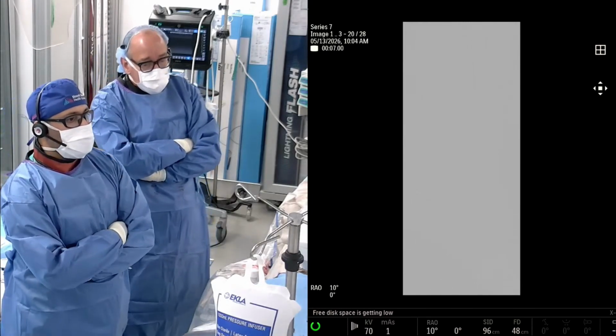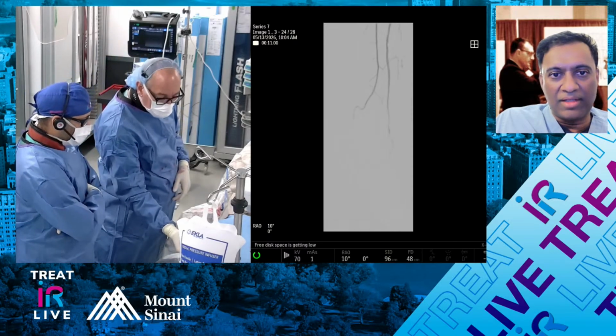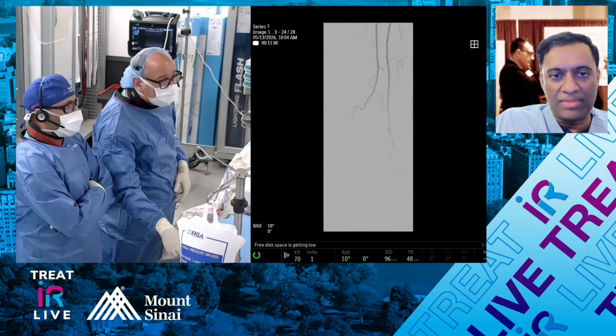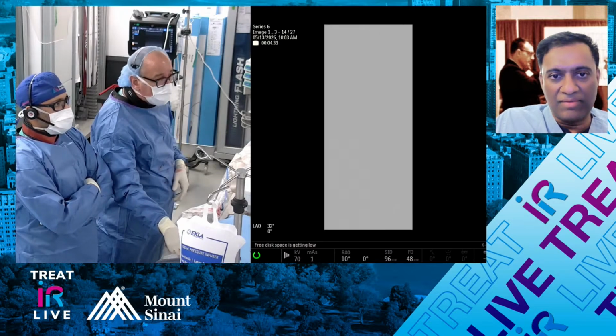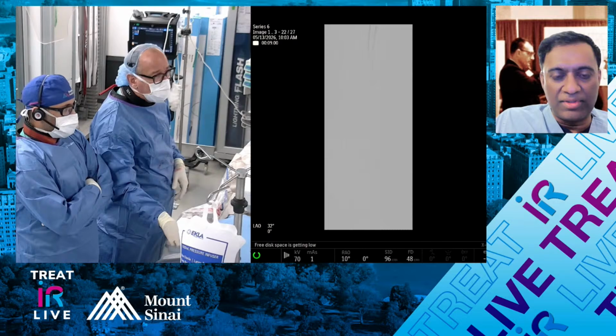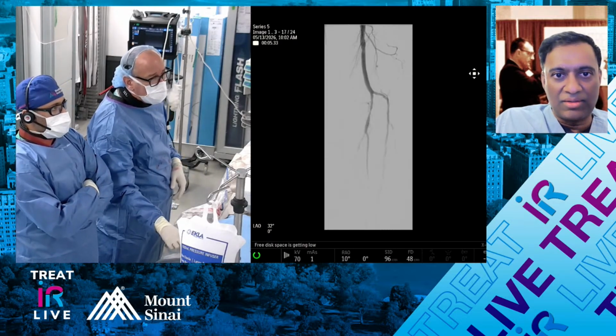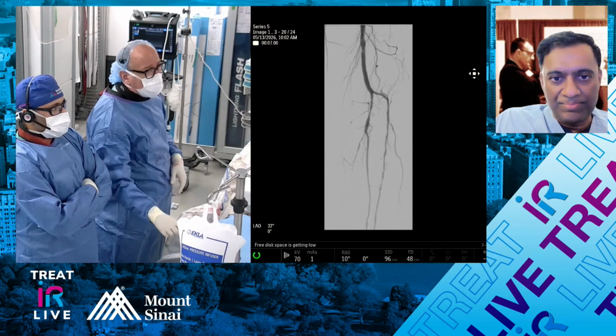Yeah, no, I agree. So the guy with kind of Rutherford 4, I would probably focus on the AT and then probably the TP trunk would be my top two kind of efforts. The AT seems to go into the plantar loop and kind of retrograde, filling some of that PT territory. So that would be my strategy.